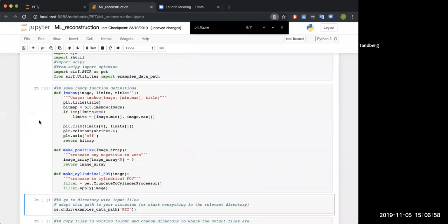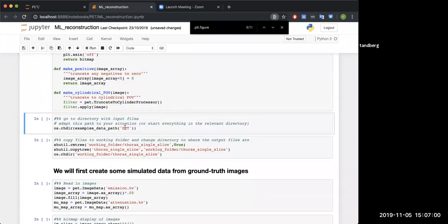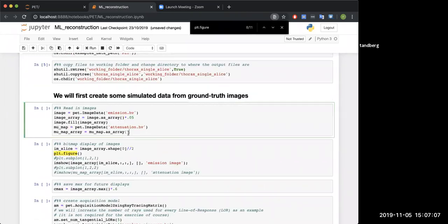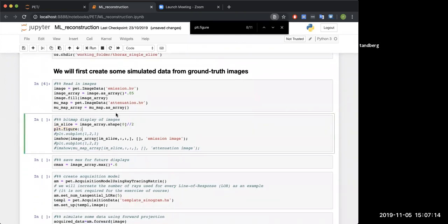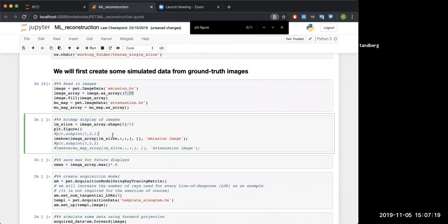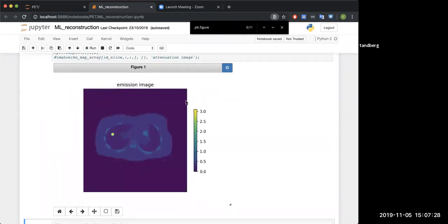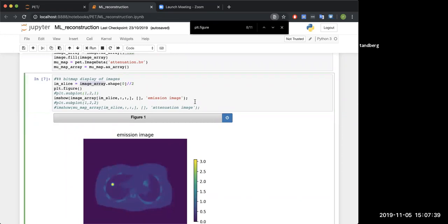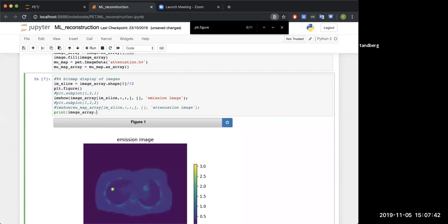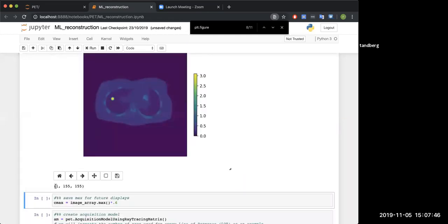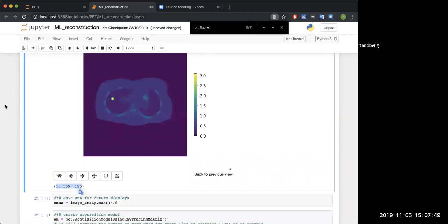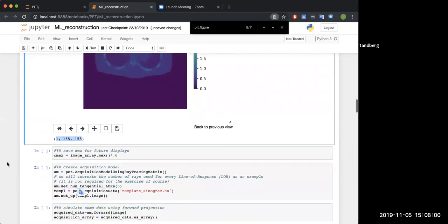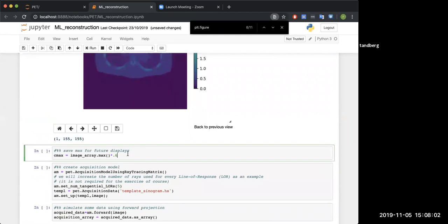All right, let's get into it. All of our normal functions, let's go into our pet examples. We'll go to a different folder this time. We're going to be working on some thorax data. Here, we'll take our emission data, our emission image, we've got our attenuation image, and we've multiplied our emission image by some value to create new data. We do an imshow to show what that looks like.